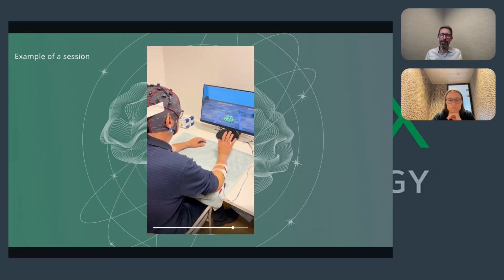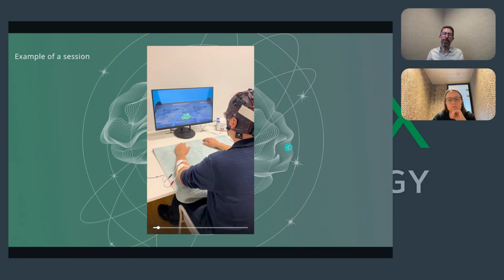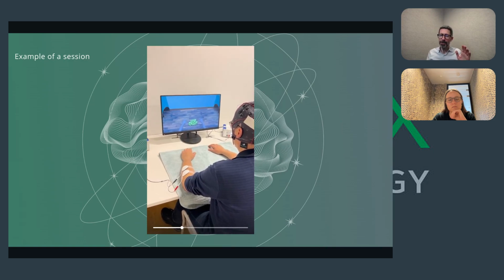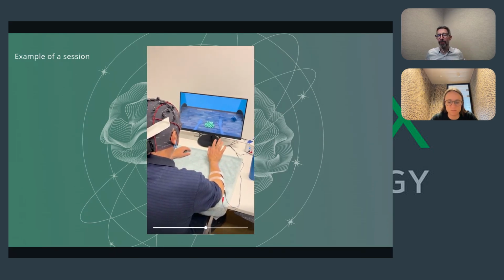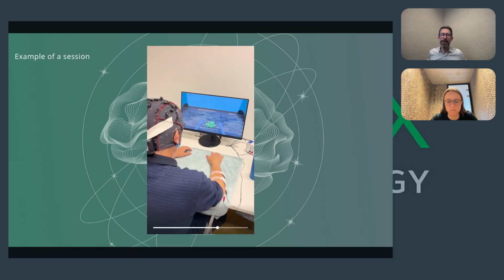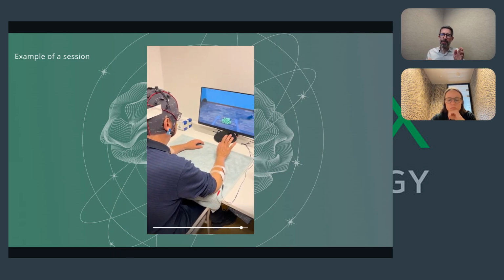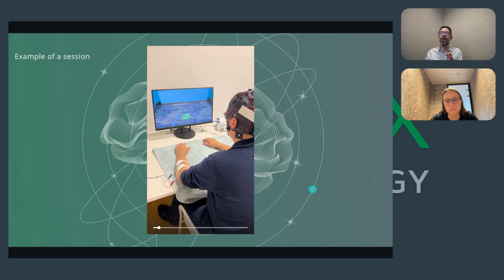It is tiring over a session, because in one session every patient does 240 repetitions of lifting the arm, with the imagined arm movement as the starting point. As soon as the arm comes up, at some point there is a command saying relax, that's enough. We only want people to lift the arm for about 4 or 5 seconds, depending on when they start. So every cycle is 8 seconds. You get an attention prompt, saying watch out, you're going to get a command. Then you're told left or right after 2 seconds. It takes another second or so to react. And as the person moves through the imagination process, the arm comes up.